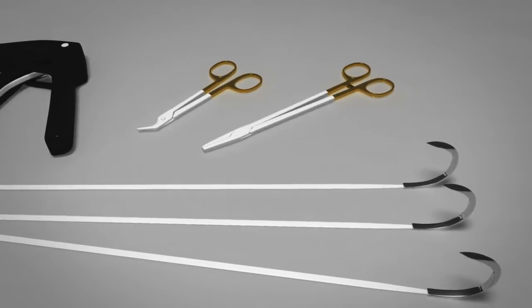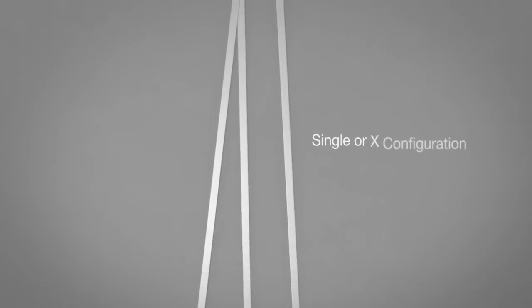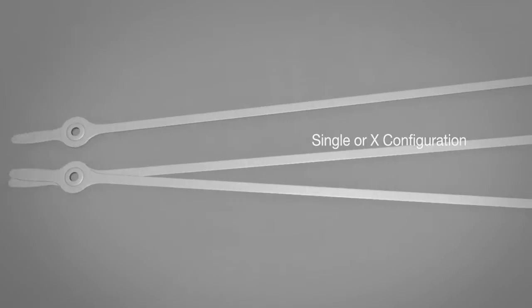This stainless steel strap comes in a single or X configuration and may be used in conjunction with or as a replacement for standard steel wire. The strap has a sequentially widening body to make delivery easier.